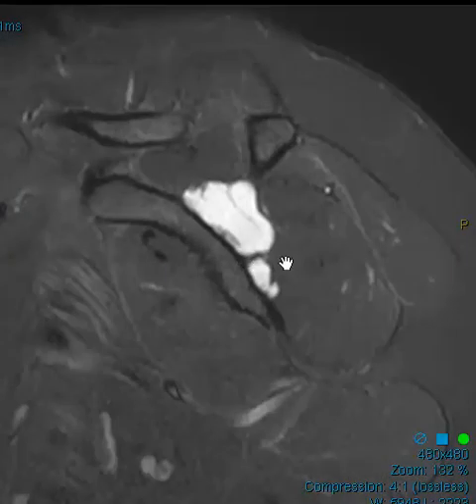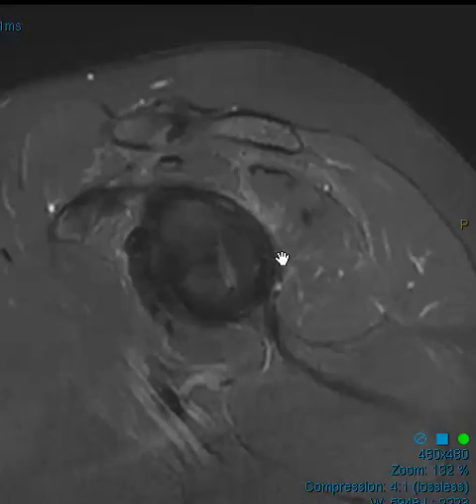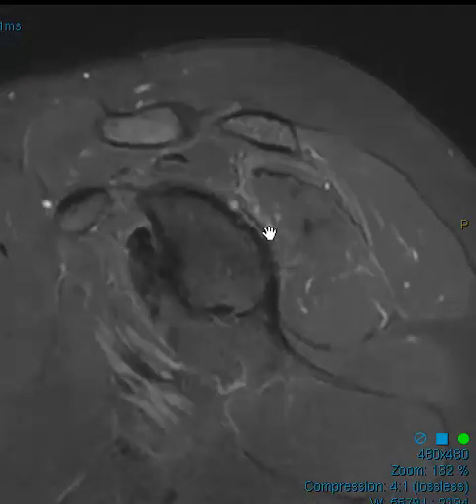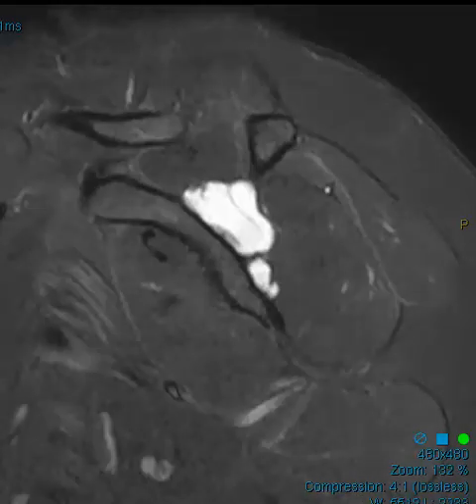The other thing is, could it be a ganglion cyst in the spinoglenoid notch? This is an appropriate case to hedge — it could be either. Moving towards the labrum, we do see this vertical band of brightness here — it probably is part of a paralabral cyst, but again very difficult to tell.